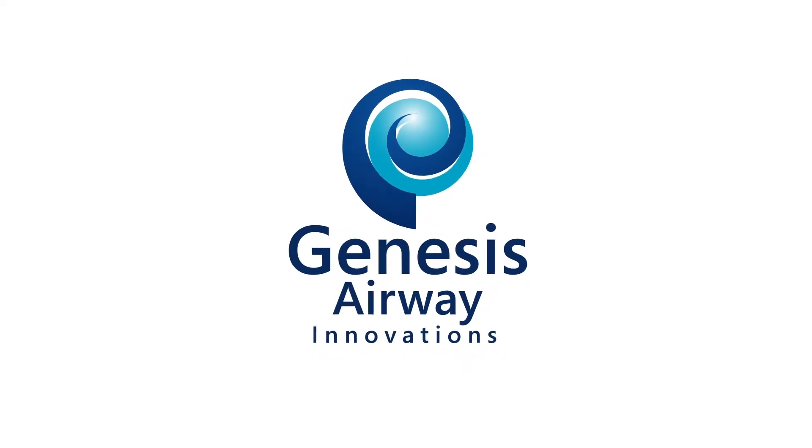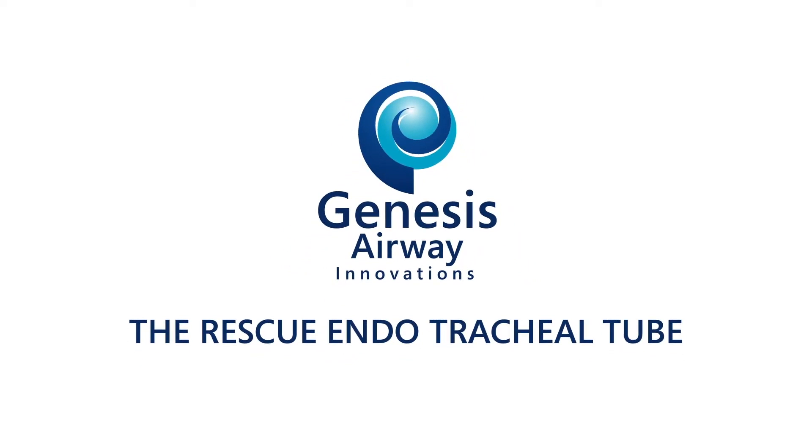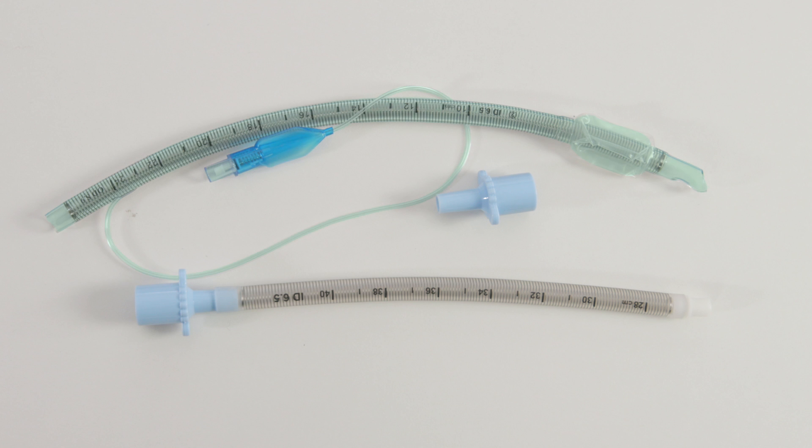In this video, we will be demonstrating the use of the Genesis Rescue endotracheal tube. This pack contains a modified endotracheal tube with a posterior facing bevel, curved atraumatic tip, and removable 15mm ISO connector.